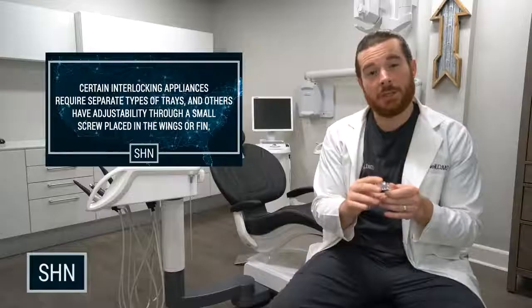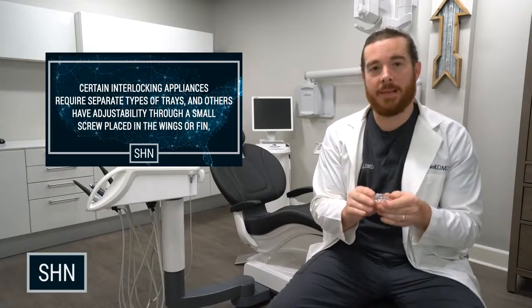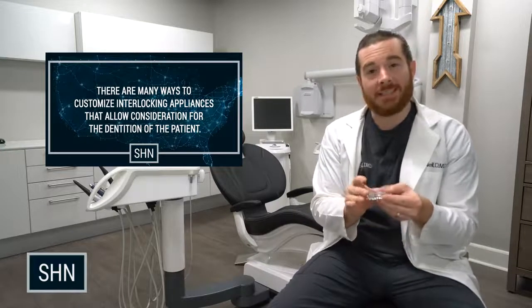You can even customize the appliance and add space for elastic hooks. If a patient is a mouth breather, they can use small orthodontic bands to help keep the mouth closed at night. You can also add lateral movement on the side wings.